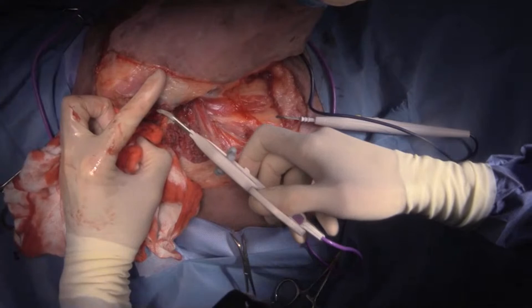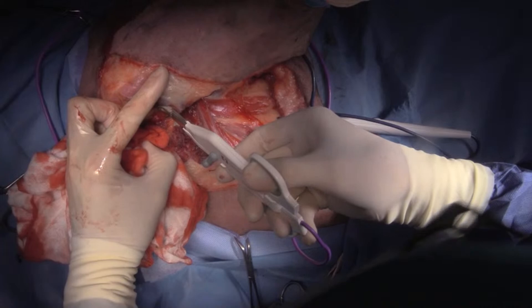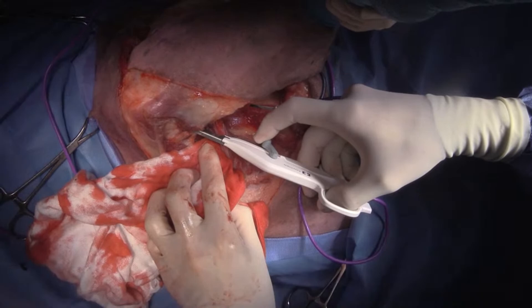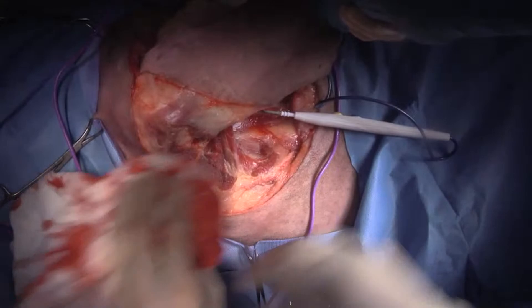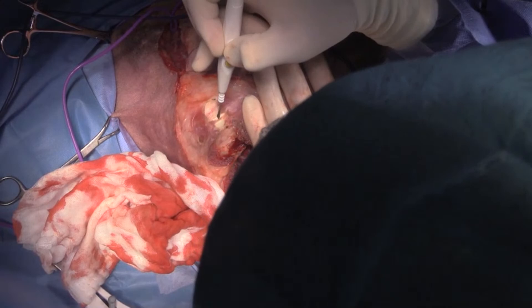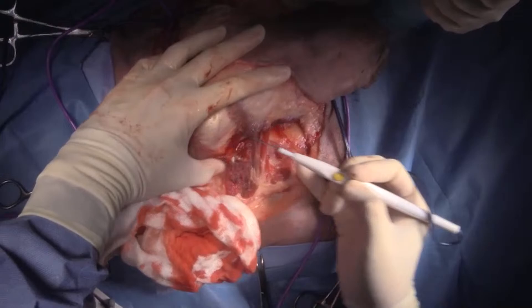Such a big dog — we're getting a lot of bleeders that normally we would just cauterize. I remember doing a Great Dane when I was on placement. Did it bleed a lot? Yes. Just put that up a little bit.